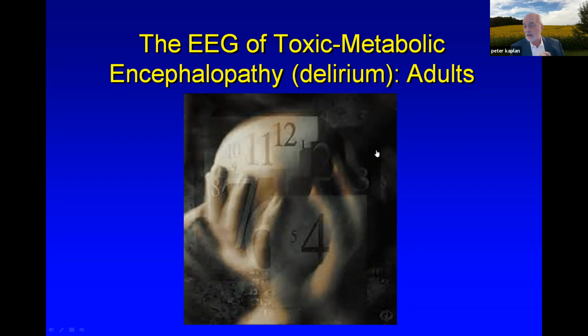There's more recent data, though, that is better. And that is that you produce metabolic damage even at discharge rates as slow as 1 per second if you do a PET or SPECT scan. You can see increased flow. So probably we'd have to revise it downwards. And in fact, PLEDs can produce that. So the idea of a certain cutoff at 2.5 per second, I think it's more important to see what the clinical correlate of the patient is.